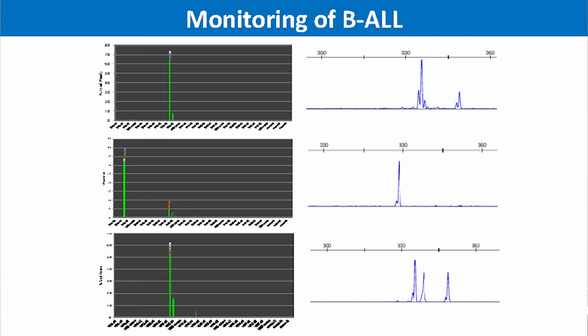So we're trying to see exactly for these patients that are getting some type of immunomodulation or immunotherapy, what happens, what are those additional clones that we're seeing, but these clones do happen to survive after they're being treated, so we have to follow up a little bit more.